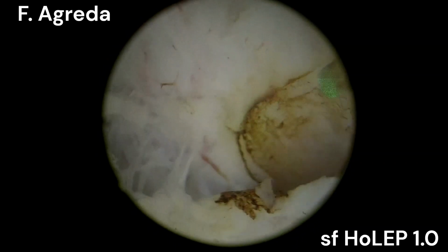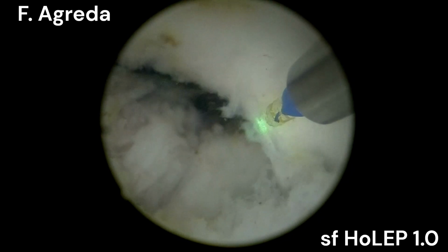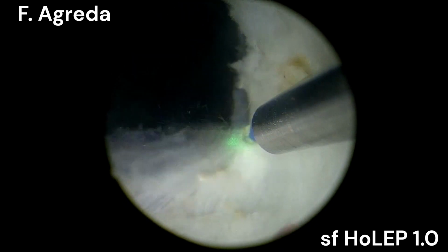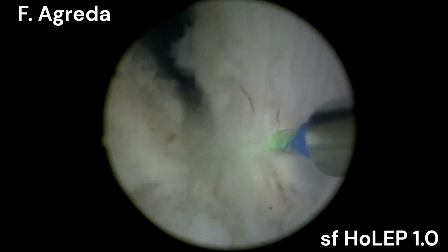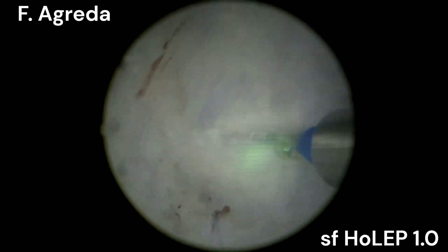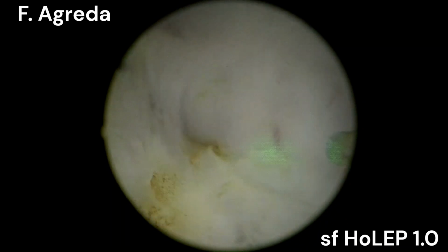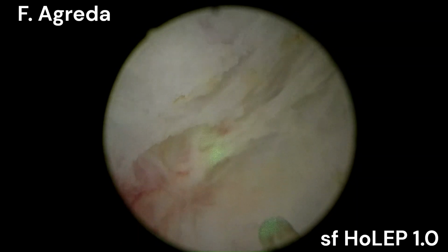So now the progression is, as I always do it, I progress in a lateral to medial way. So we are going from 3 o'clock here around, we're progressing to the 6 o'clock. So we're going from lateral to medial. I have no proof of this, but I think this way of dissection diminishes the probability of doing some perforation when you do the ascension of the dissection here beneath the bladder neck.